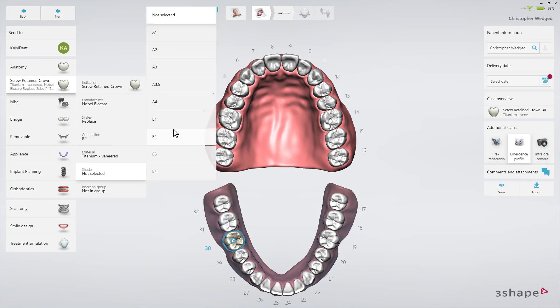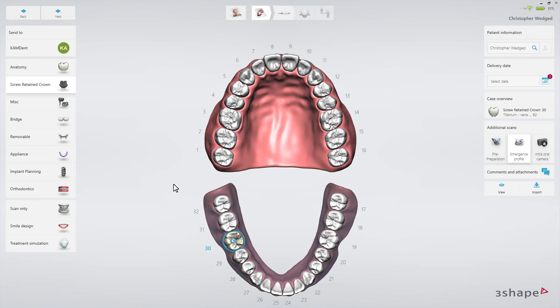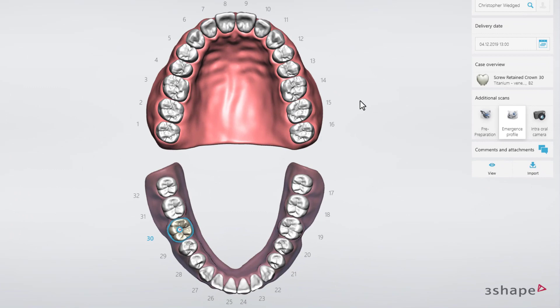If you select a Screw Retained Crown, you may also specify a shade at this point. The Emergence Profile scan is selected by default. This is the recommended workflow due to the ease of use, but you may deselect the Emergence Profile if you prefer to scan only the scan body. You'll also have the option to add a pre-preparation scan if needed.